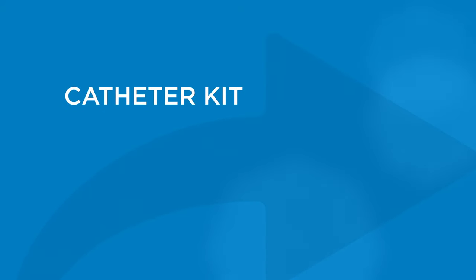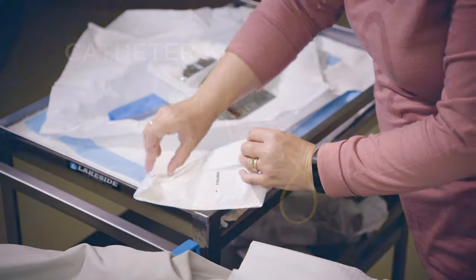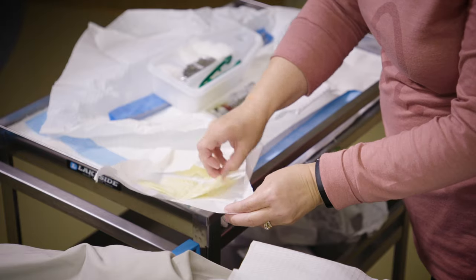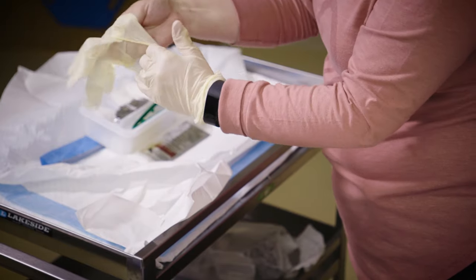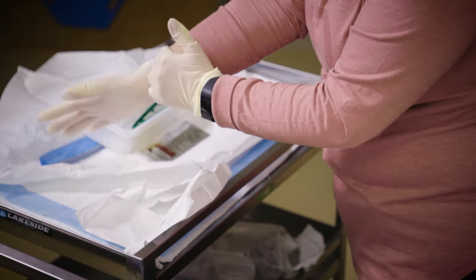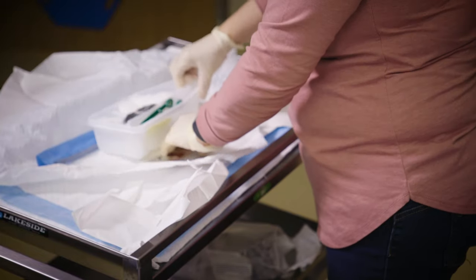In the catheter kit, remove the drape, which is the top layer of the kit. Discard the drape. Underneath the drape, you will find a package of sterile gloves. Do not open the package of sterile gloves over your clean work area. Open the sterile gloves to the side or away from the clean work area, then put on your sterile gloves. You can now touch all of the items in the clean work area.